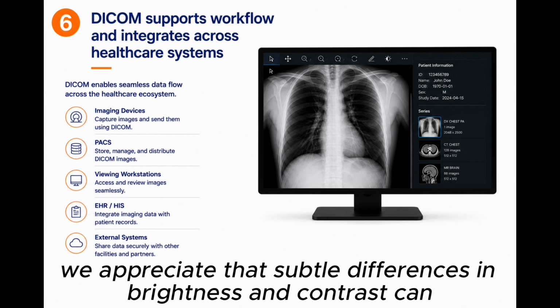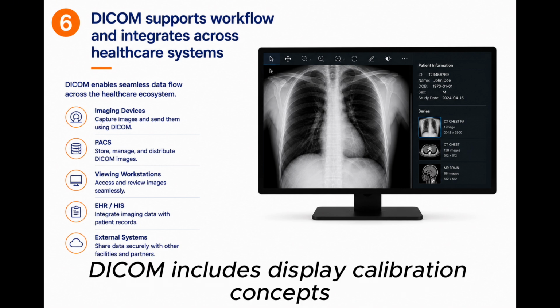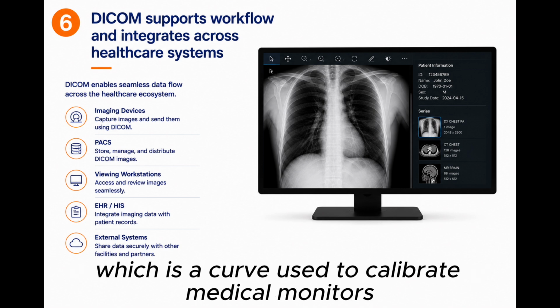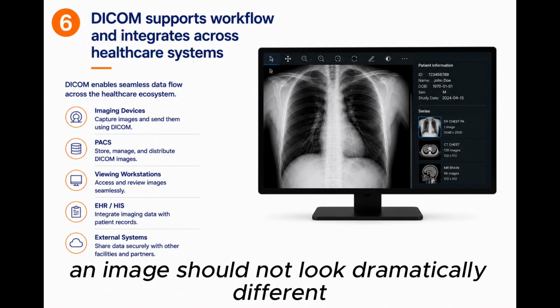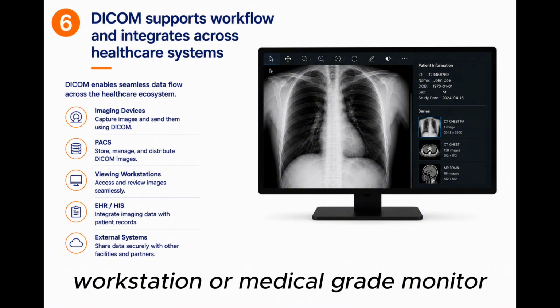We appreciate that subtle differences in brightness and contrast can make a very big clinical impact. DICOM includes display calibration concepts, such as what we call the grayscale display function, which is a curve used to calibrate medical monitors. And again, the goal is consistency. An image should not look dramatically different just because it is displayed on a different diagnostic workstation or medical grade monitor.